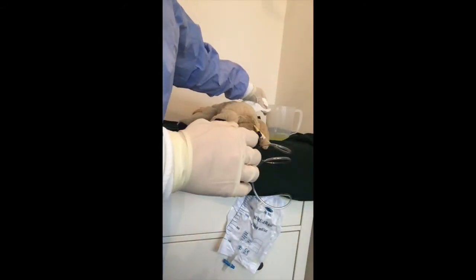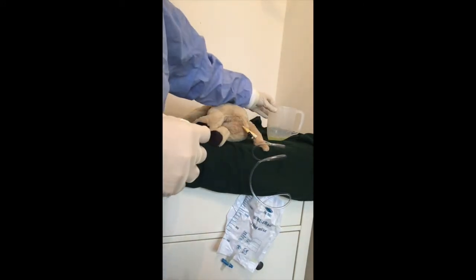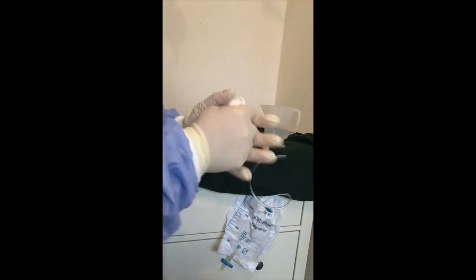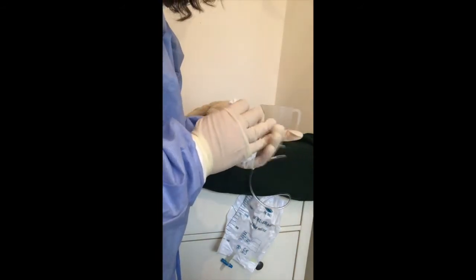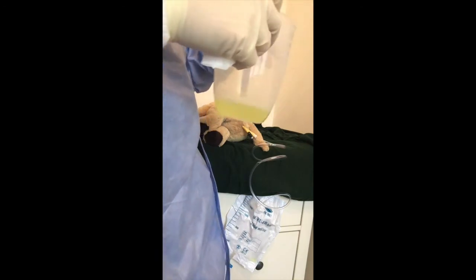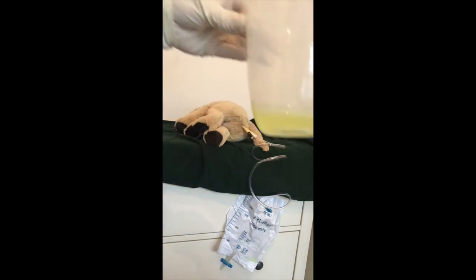I need to put this on a flat surface to read it. If you're not shaking in the exam, yes, you could read it holding, but don't rely on your hands not to shake. In here is 50ml that I have.